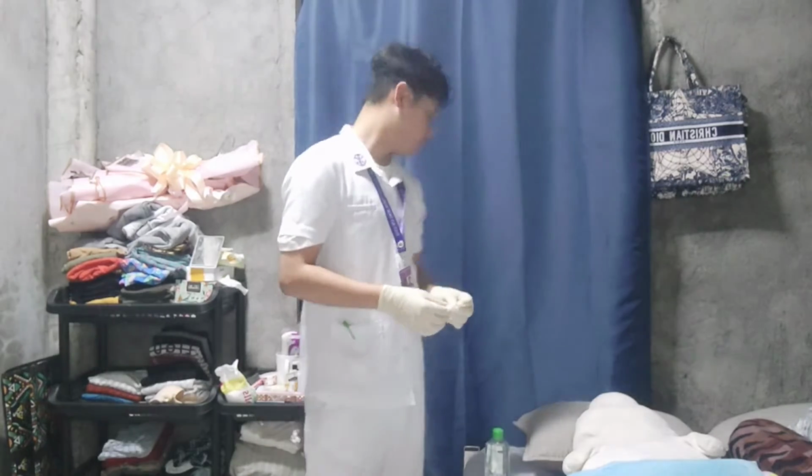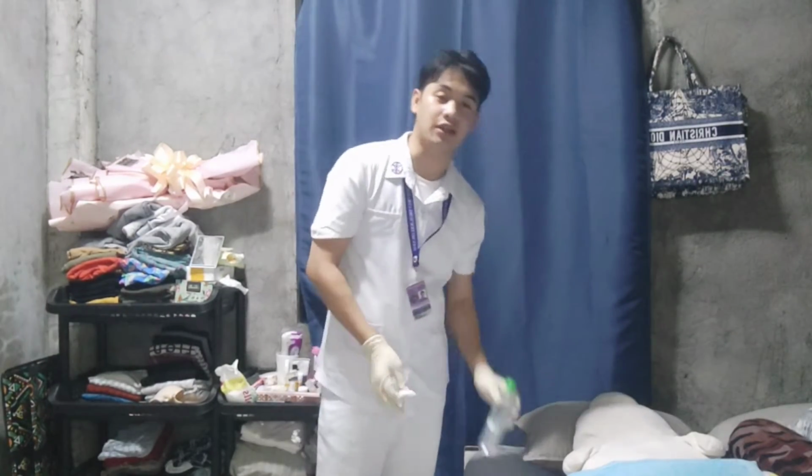So this helps to avoid hemolysis and to keep it uncontaminated. So we are going to use cotton with alcohol. So we're gonna rub it on the patient's side. We're going to administer the injection.